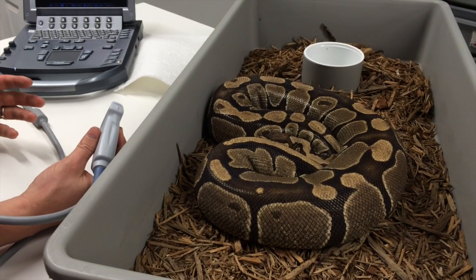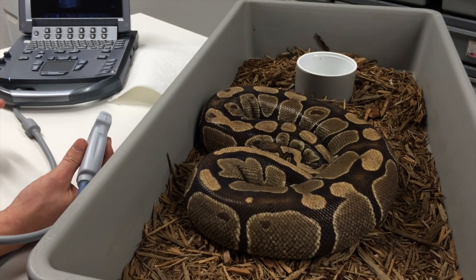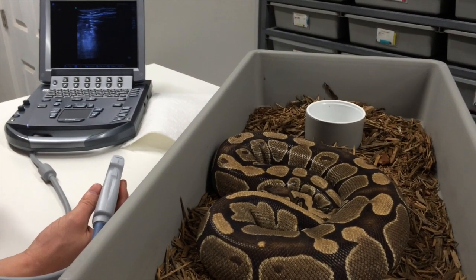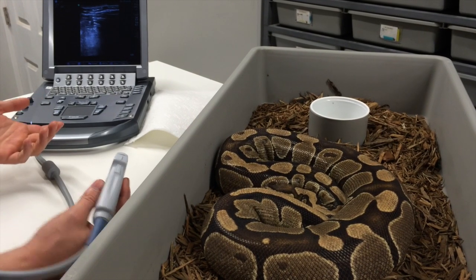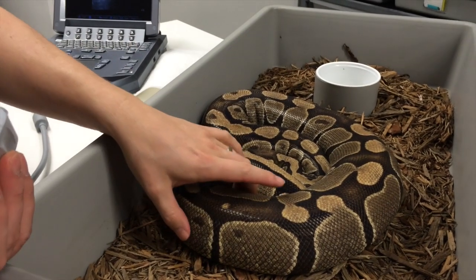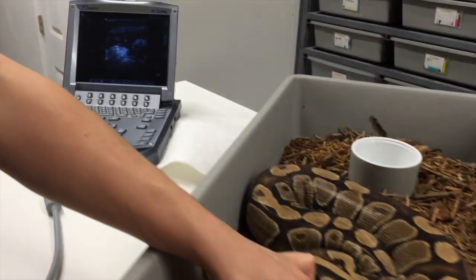This is the first female we ultrasounded in the last video. On January 23 she had 2.0 centimeter follicles — that was my estimate. We're going to go ahead and look at them to see if they've grown since then. She has been bred one time this year by a leopard yellowbelly, so should be a neat little clutch. Let's take a look and see what we can see.